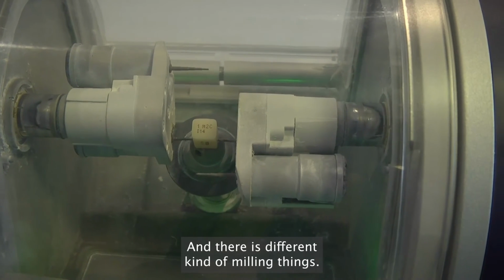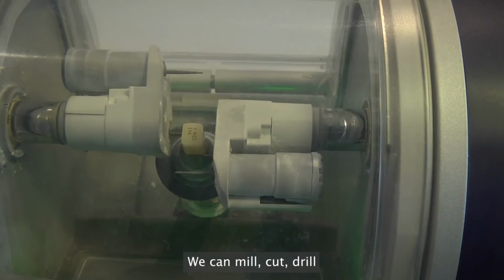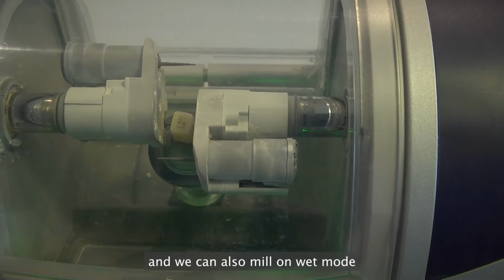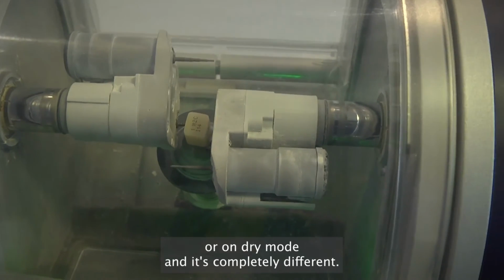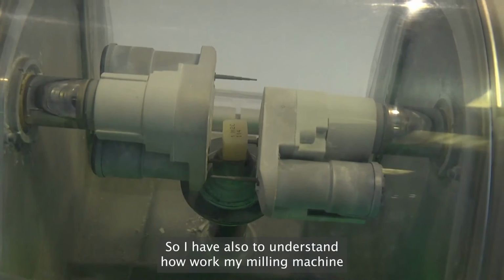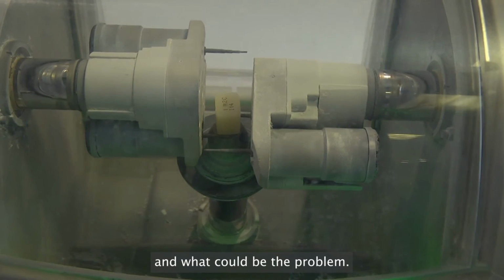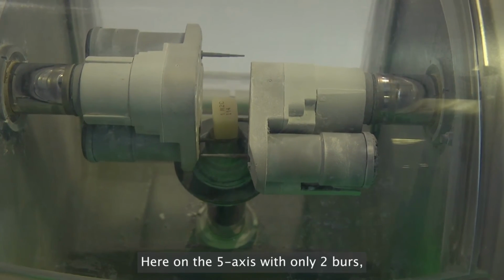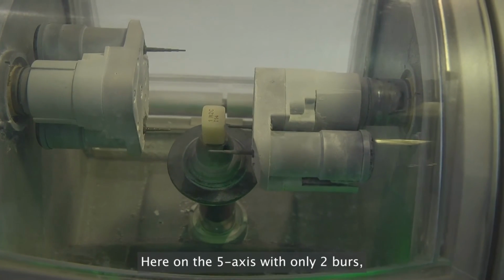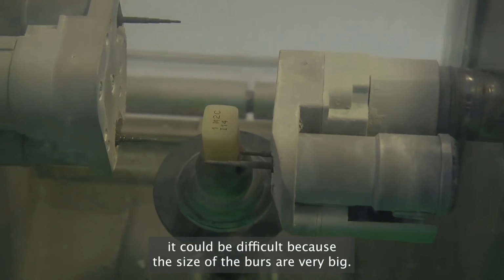And there are different kinds of milling operations. We can mill, cut, drill, and we can also mill in wet mode or in dry mode. And it's completely different. So I also have to understand how my milling machine works and what could be the problem. Here on the 4-axis with only two burs, it could be difficult because the size of the burs is very big.